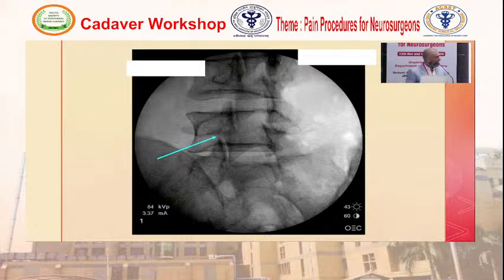So basically you don't need anything else. You just need to concentrate on the pedicle: below the pedicle is the foramen, and superiorly and medially is the facet. Right at the eye of the Scotty dog is the medial branch. And if you have to do any percutaneous procedures for the disc, you enter through the superior part of the pedicle. I think we'll take a break, sir, and we will continue later.